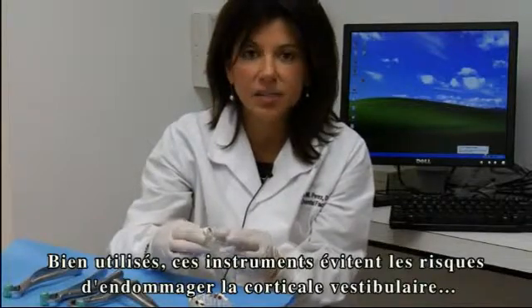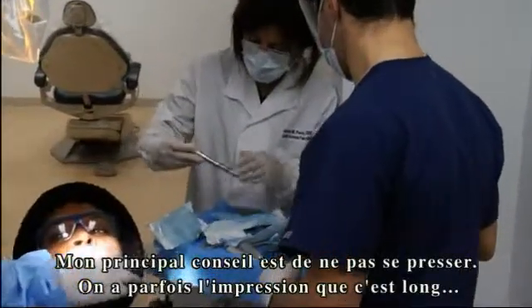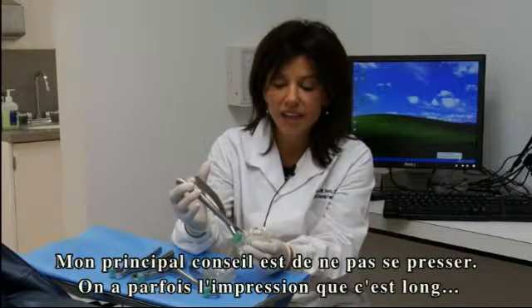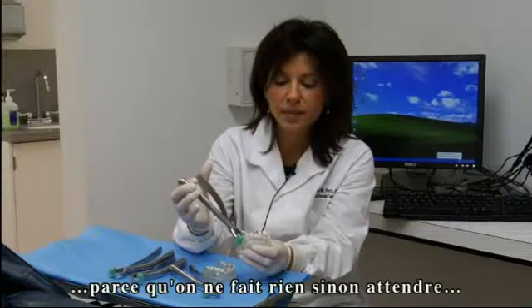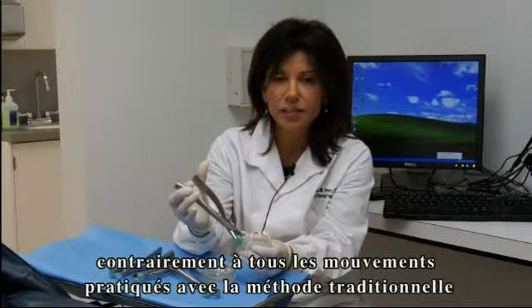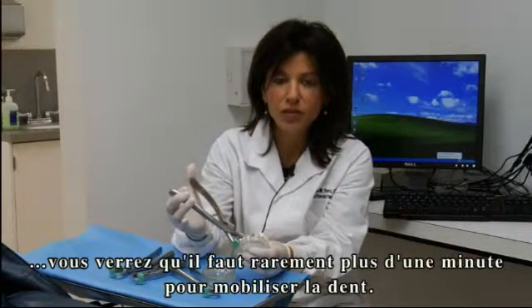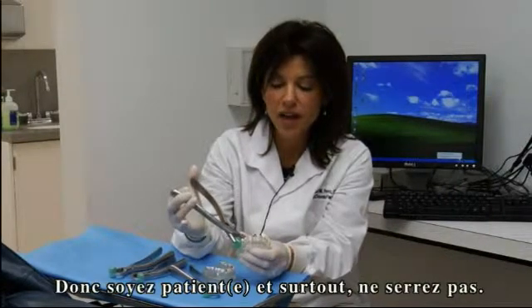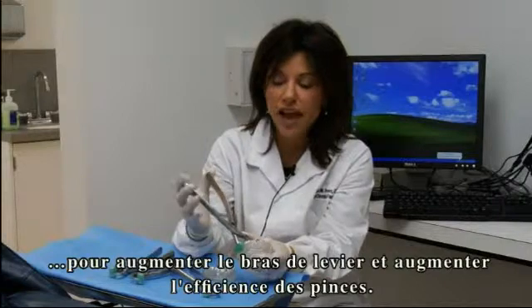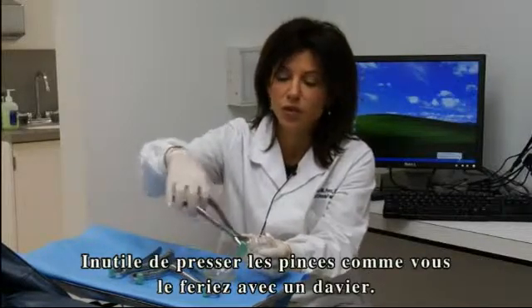If done properly, it prevents any damage to the buccal plate and the teeth can be removed quickly, efficiently, and atraumatically. Go slow and do not try to rush the procedure. It may feel like it takes a long time because you're not doing the multiple movements used with conventional forceps — you're simply holding a resistance on the tooth. It rarely takes more than a minute to get movement of the tooth out of the socket. Just be patient, hold the pressure on there, and remember not to squeeze. Being very far back on the handles helps a lot because it increases your leverage and makes the forceps work more efficiently. You don't want to choke up on the handles.